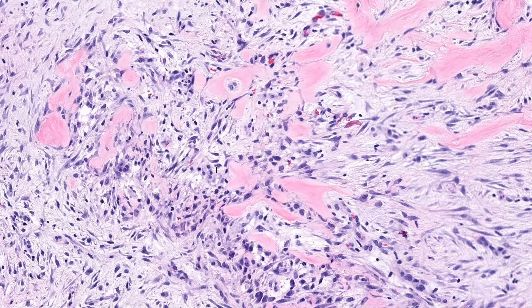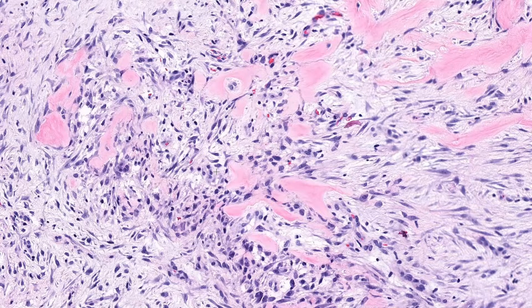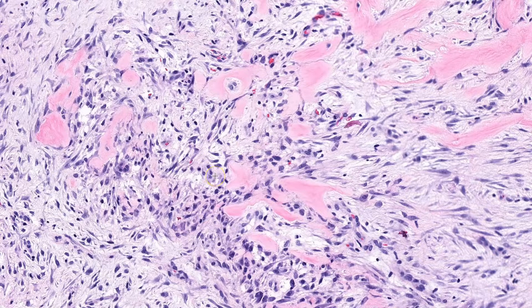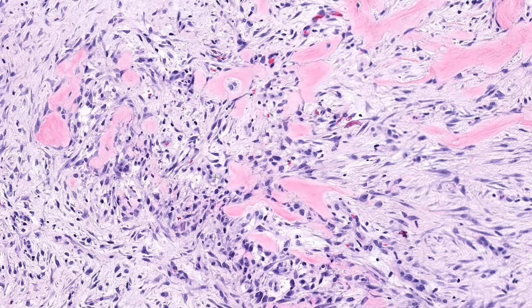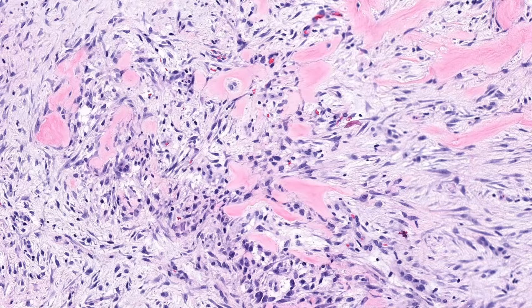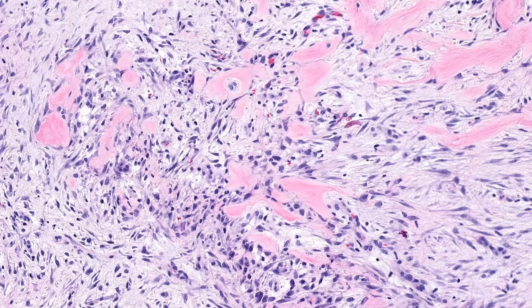At first glance, you might think these cells look a bit unusual and that might make you worry about a sarcoma, such as osteosarcoma. However, you'll come to recognize that this pattern and morphology is really characteristic of myofibroblasts. This is an example of myositis ossificans, a benign myofibroblastic neoplasm that is part of the USP6-rearranged family of tumors, which includes, among others, nodular fasciitis and aneurysmal bone cyst.